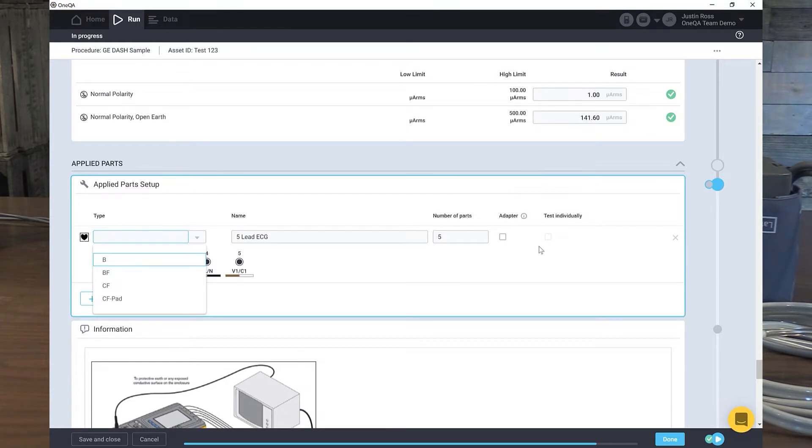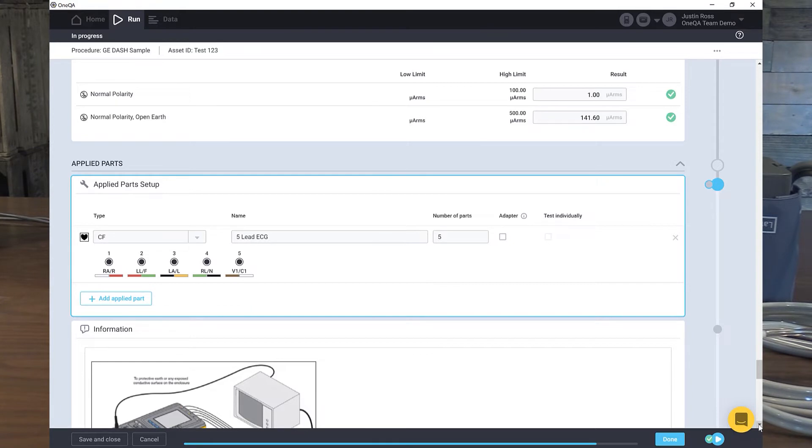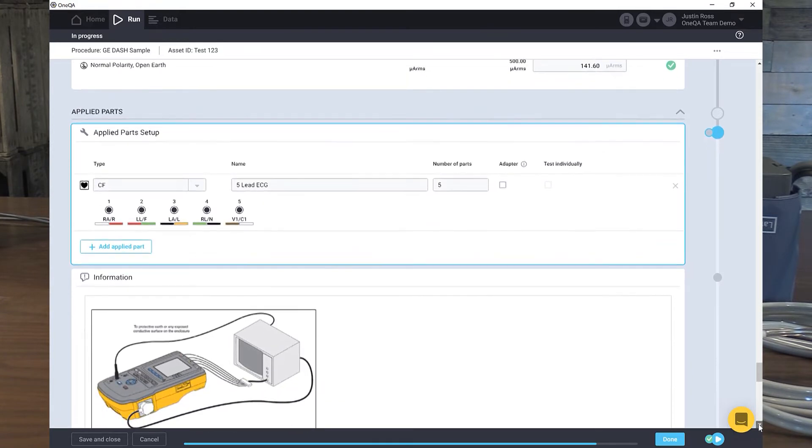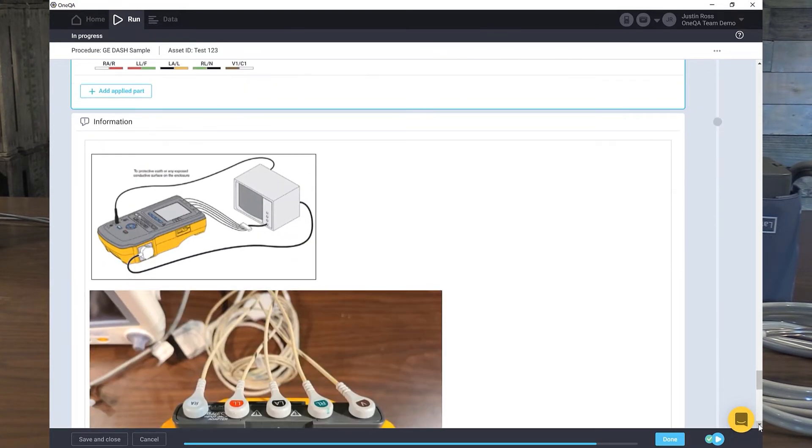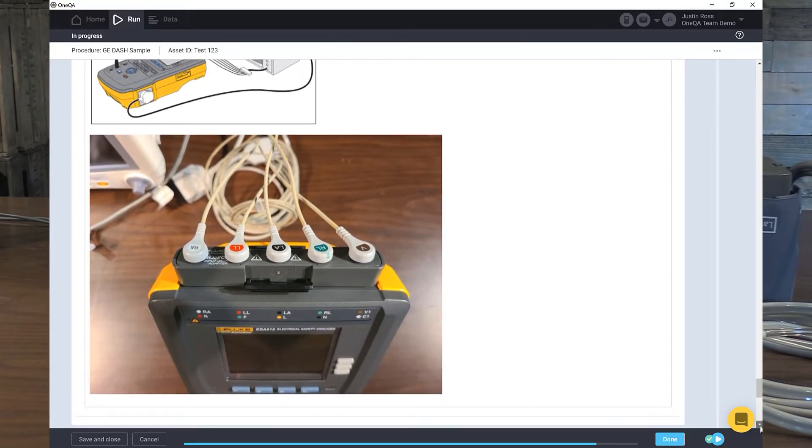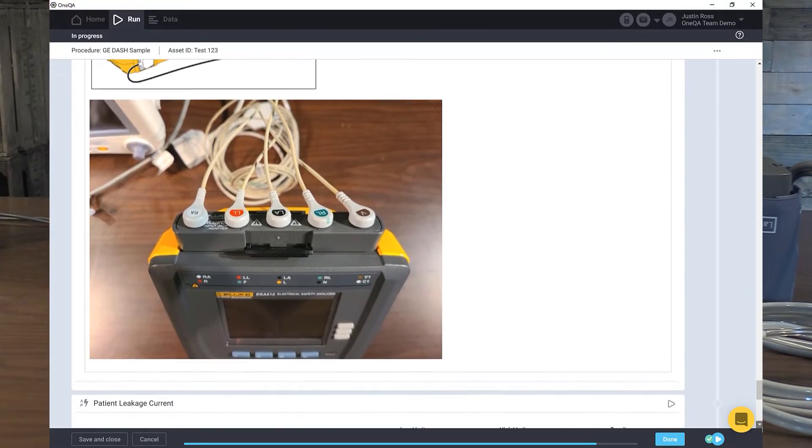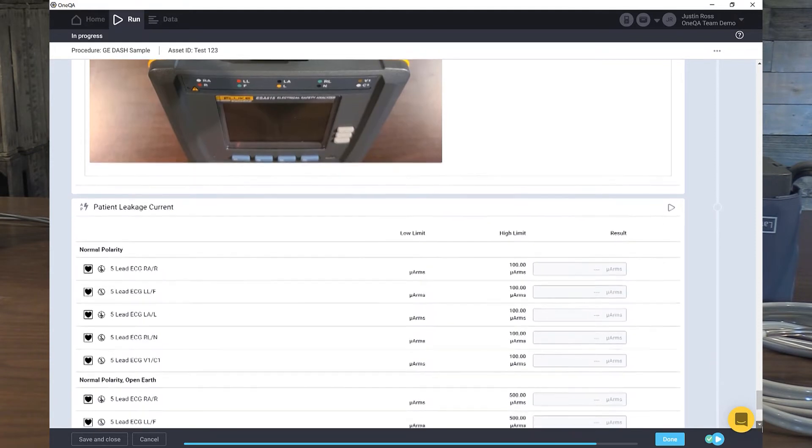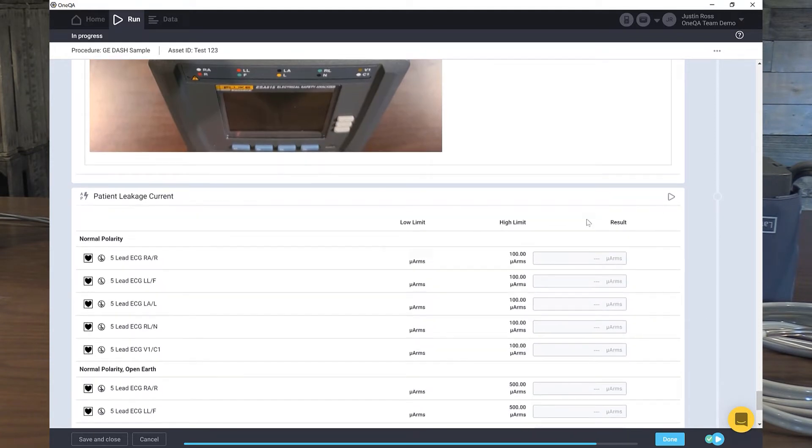We're going to move down to the applied parts test. Here's how to set it up. Here's the diagram and here's a picture. We'll follow and make sure we have the picture set up. Yep, we're connected over there. Let's go ahead and start this test.